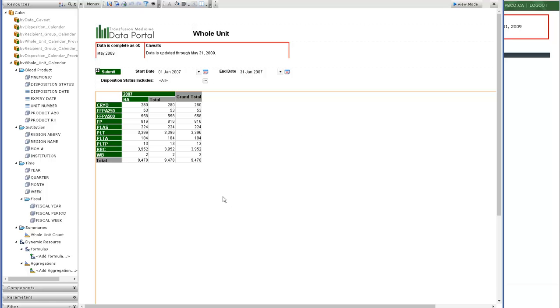So as noted, within this cube we see components only, red cells, platelets, plasmas, cryo, and, in this data set anyway, the occasional whole blood unit. If we wish to extend or shorten the date range that we're looking for, we do that through the parameter block.